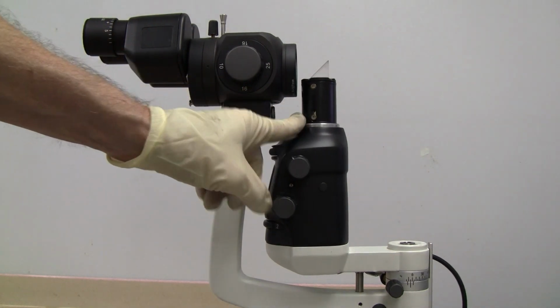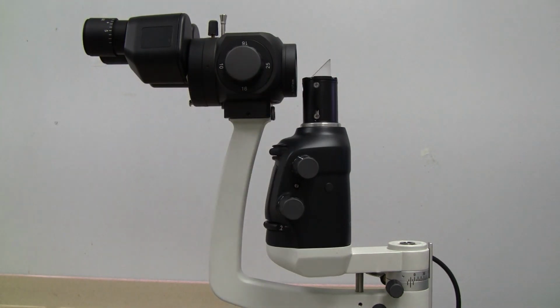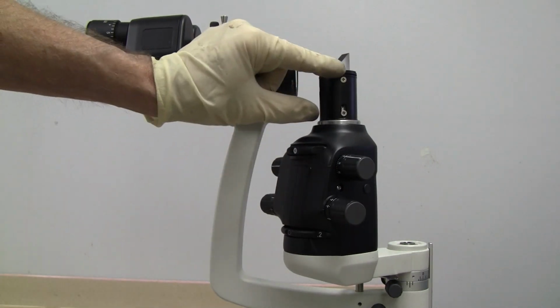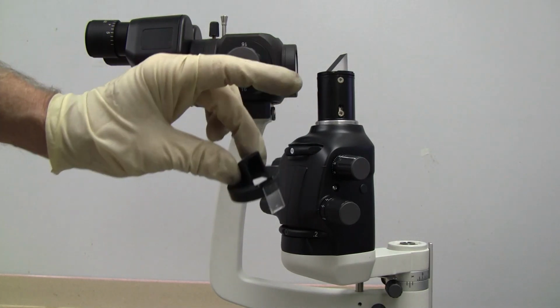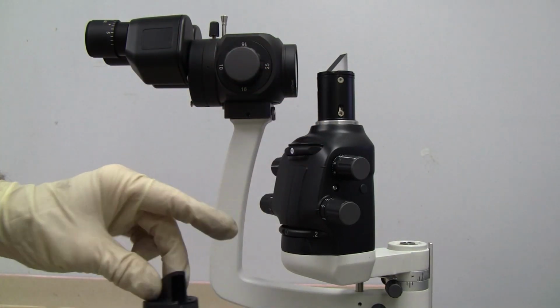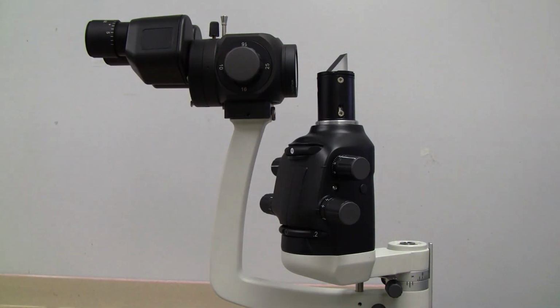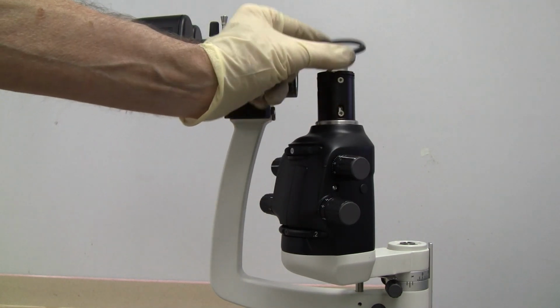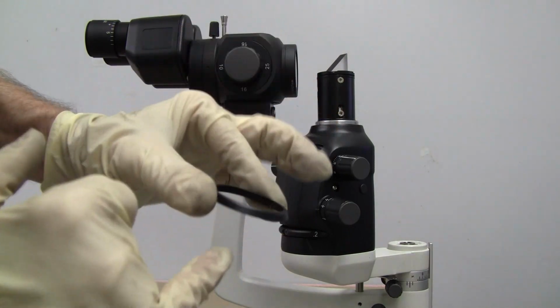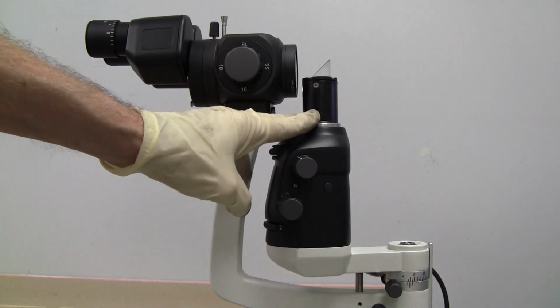As you see here, I have this cover off of this prism assembly, and this will come off, and I have the prism cover off by 2 screws. Got the filter on it, and it has a ring on it underneath. This ring can be removed by 2 small Allens.